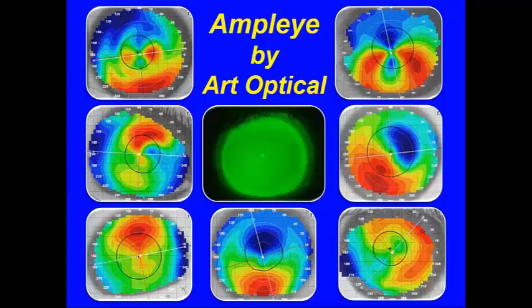It's been quite a workhorse for us over the past few years, but there are others on the market, and it's worth taking a look at all of them before you purchase one, making sure it has all of the features that you're looking for: the axial display, the elevation displays, the tangential displays, and provides you with as accurate readings as you can get.